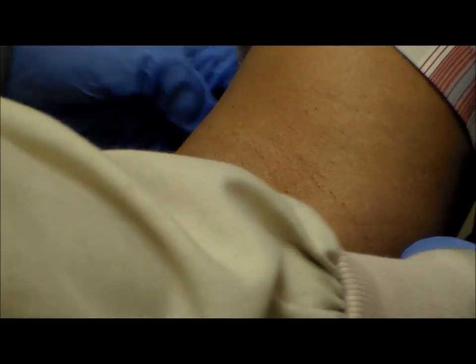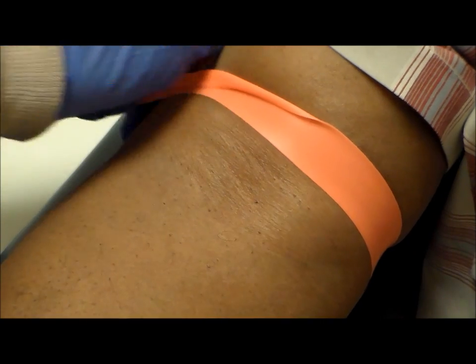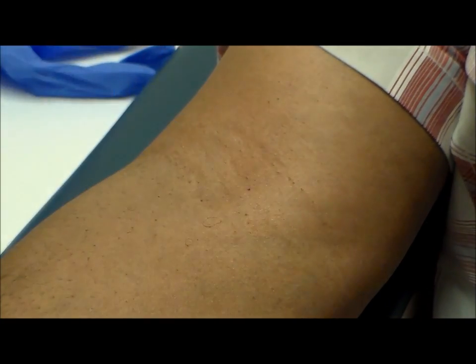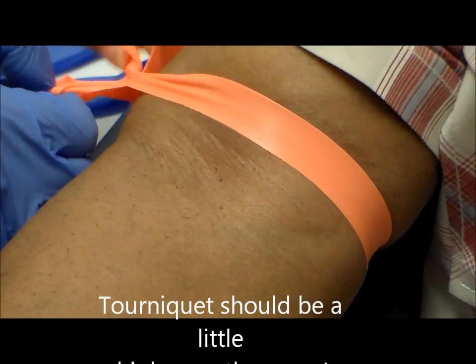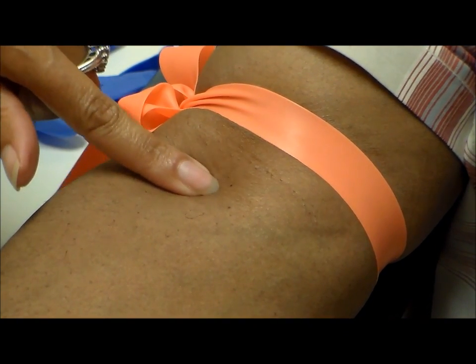There is really not a slow pace you can go sticking a needle in someone's arm because you really just want to get it done. So I have a willing participant here and what I am doing is assessing the arm first without my glove, because this is when the patient first sits down in your chair and you are trying to make them comfortable and you are just conversating with them. And that is what I am pretty much doing here.